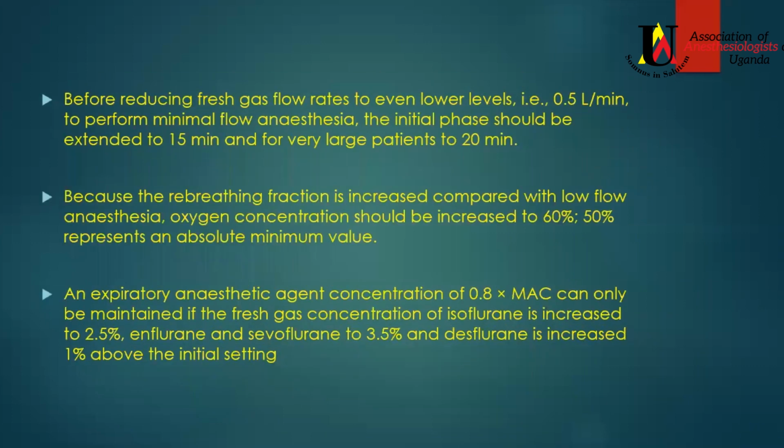Now, before reducing the fresh gas flow rates even lower, i.e. to the minimum flow, which is 0.5, the initial phase should be extended to 15 minutes. So the longer you want to run the lower flows, the longer you have to run the higher fresh gas flows, okay? Because you want this patient to really be saturated with the agent.